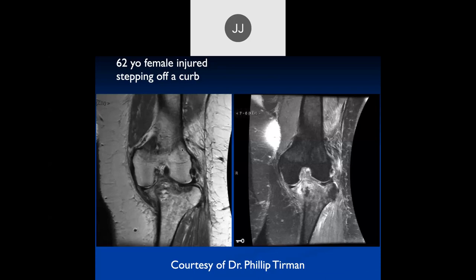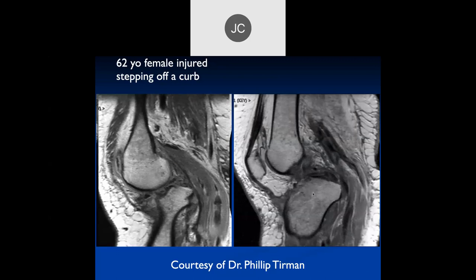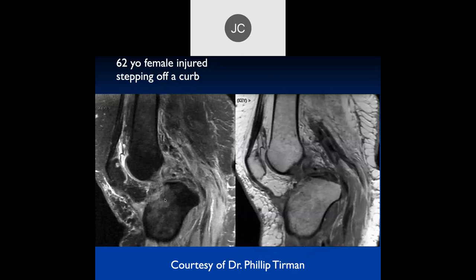We have a 62-year-old female who was injured after stepping off a curb. It looks like there's medial subluxation of the tibia with respect to the femur and extensive bone marrow edema. This is probably the ACL proximal origin, this is probably the popliteal tendon - so this is probably lateral and probably medial. There's obviously a dislocation here with instability. You need both ACL and PCL tears as well as collateral ligament tears - all from stepping off a curb. You can see the impaction injury to the tibia here.